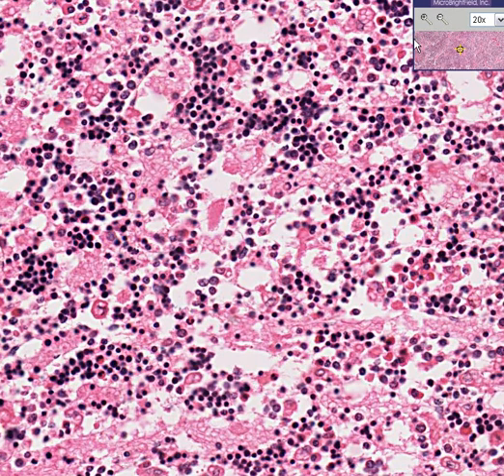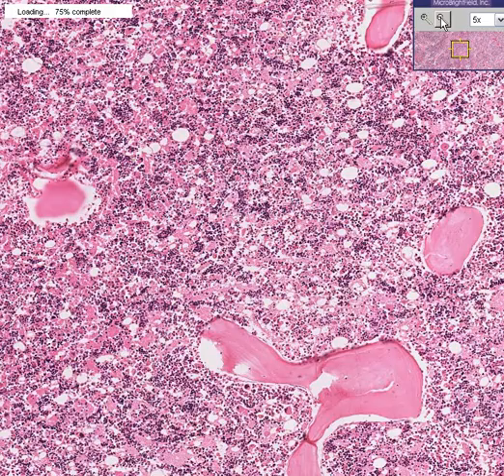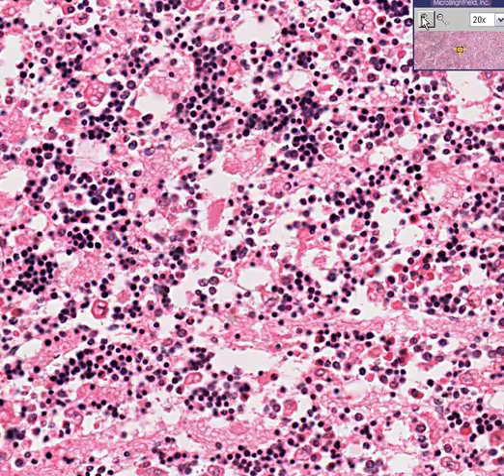So the two things we could say without going into the fine cellular detail at all is that number one, there's an increased cellularity because the fat is a heck of a lot less than 50%. And number two, rather than the erythroid cells being only about 1/3 of the hematopoietic cell population, it's a heck of a lot more, perhaps even a reversed ratio.